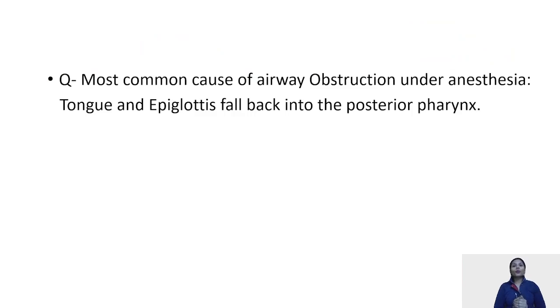Most common cause of obstruction during anesthesia. It is because of the loss of your muscles. Your oropharyngeal, laryngeal, and tongue muscles lose their tone when we give the induction agents or when we are giving the skeletal muscle relaxants to them.